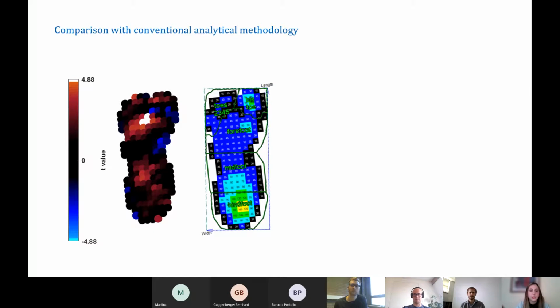If you take a look at this 5-region mask, which is one of the most used masks in the plantar pressure field, you see that they consider the forefoot as a whole. When you deal with peak pressure images, you are basically just detecting the sensors where the pressure is the highest. And if you don't know where these pixels are, you can't really tell where the differences are.